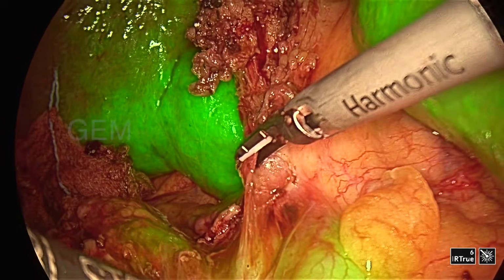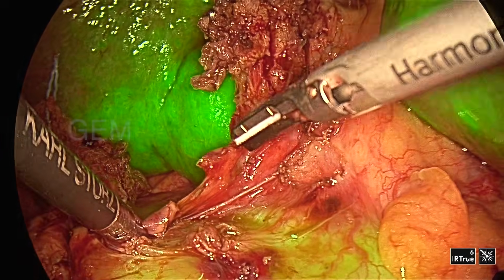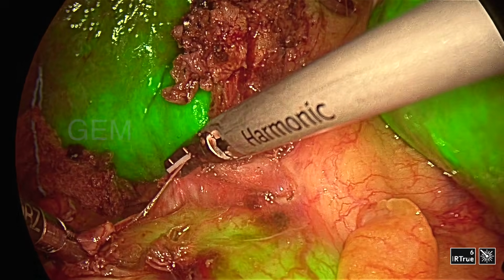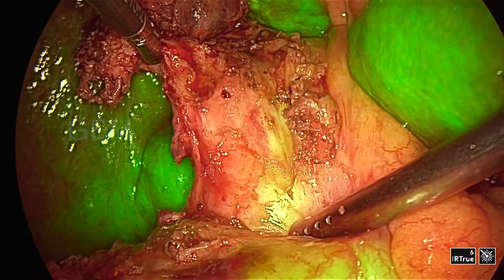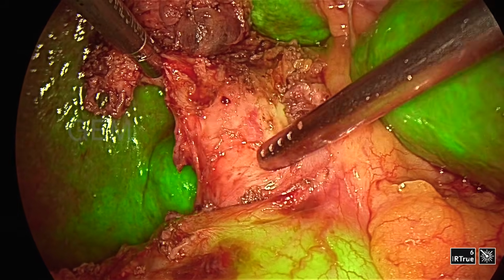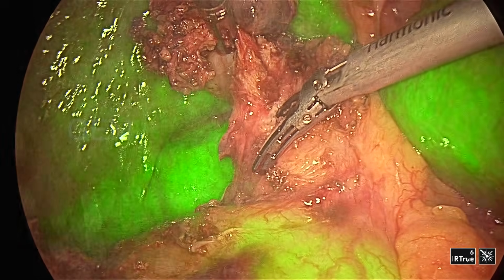So again, I am mobilizing the duodenum further down. Usually in a choledochal cyst excision or sometimes CBD exploration, we mobilize this duodenum like this. So it's mobilized down. Here I could see that hardness down till here. Another 2 centimeters I have to open.